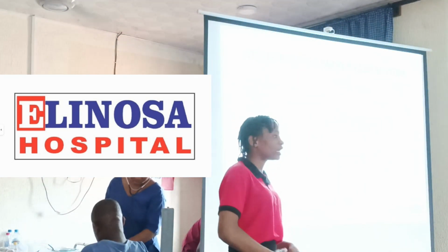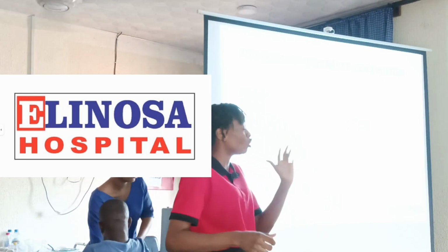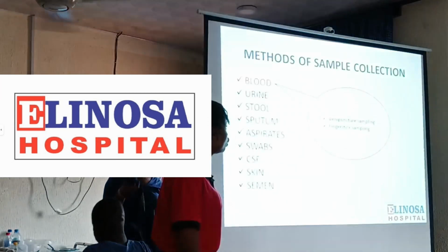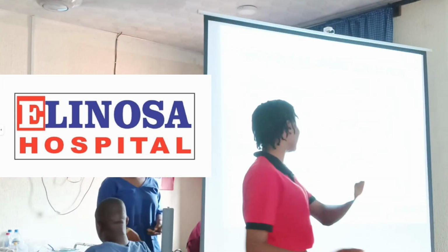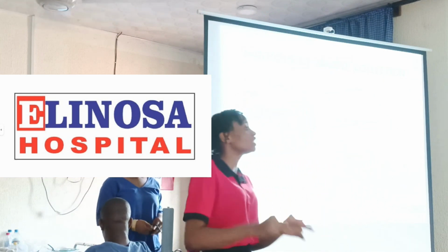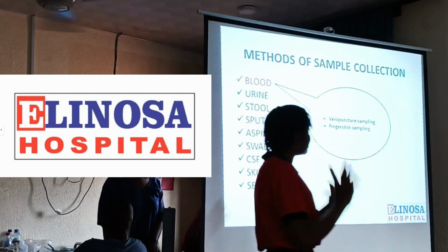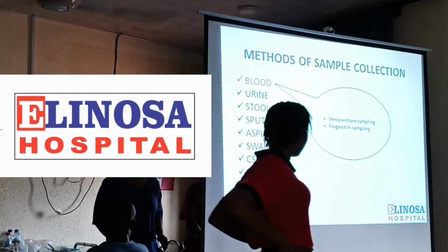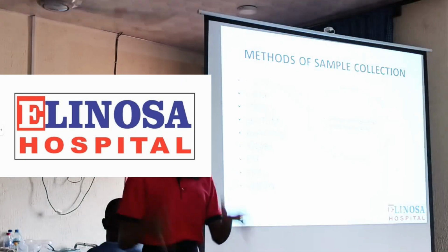You swab the area, the bladder, then from the outside you prick the patient and you see the urine start gushing out and you collect the sample inside the universal container. Now this urine, we use it for tests like urine microscopic culture and sensitivity. We also run tests using urine called urine analysis, that's urinalysis, using the dipstick method to check for the state or pattern of the human system, because urinalysis gives a general picture of how the human system is, if there is any abnormality in the kidney or urinary tract.